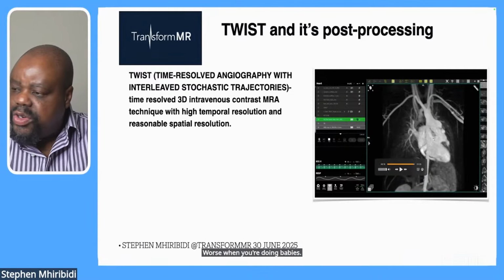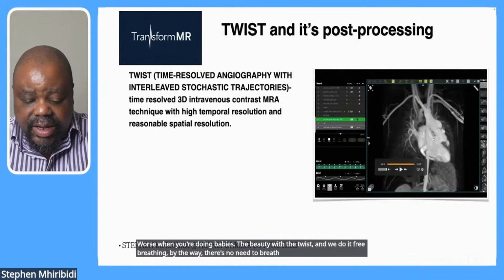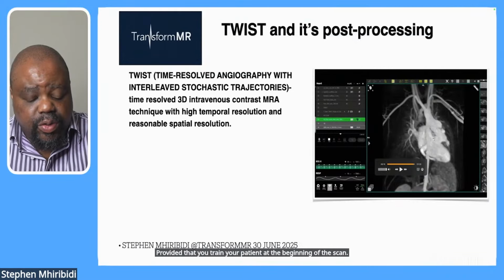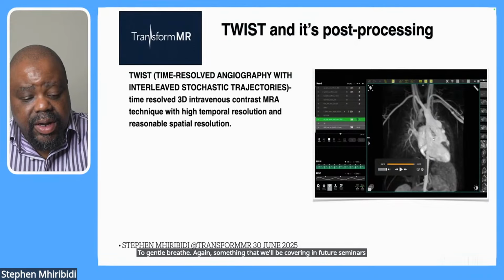Now, the beauty with the TWIST, and we do it free breathing, by the way, there's no need to breath hold, provided that you train your patient at the beginning of the scan to breathe gently. Again, something that we'll be covering in future seminars on patient preparation.